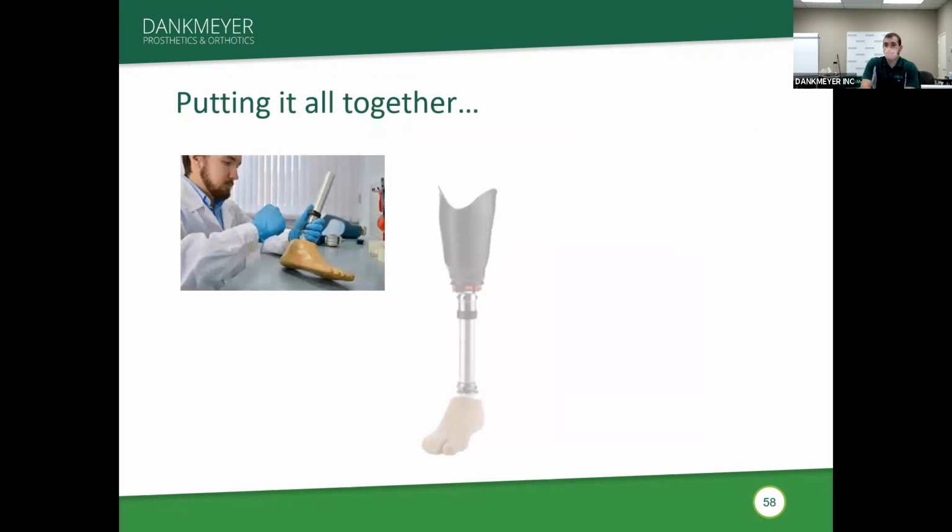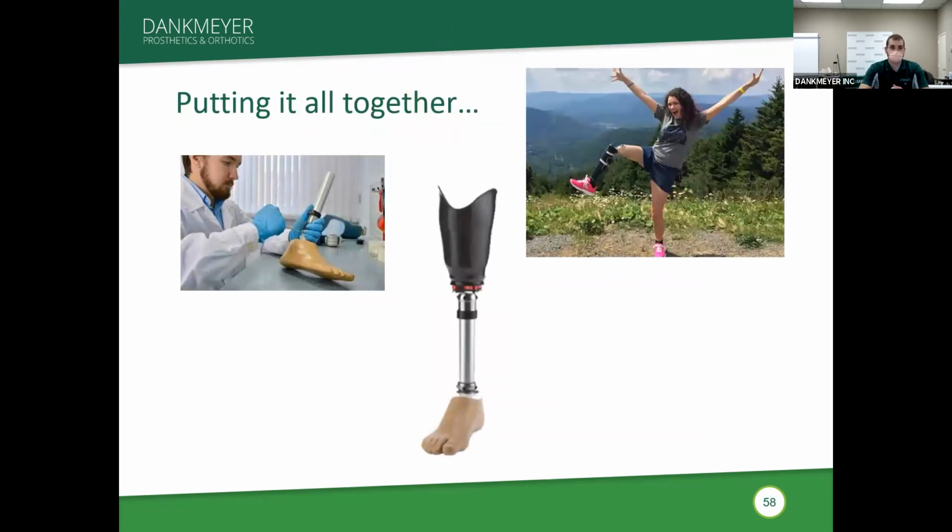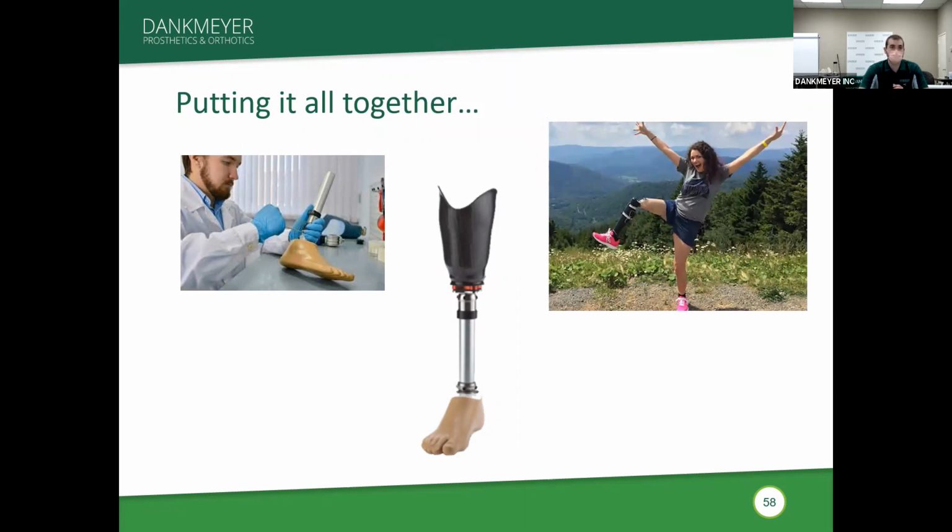And that brings us to the end. So once you've got your socket, your interface, your knee, your endoskeletal components, and your foot, you've got a prosthesis.